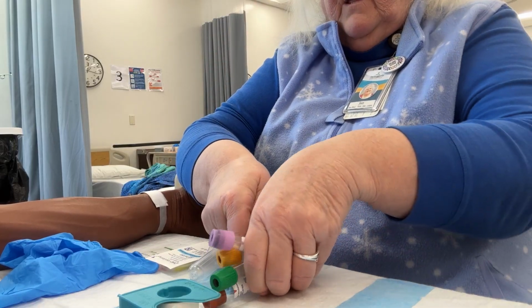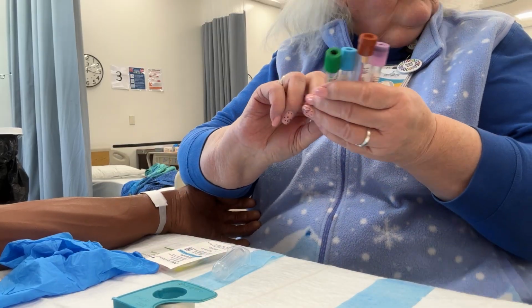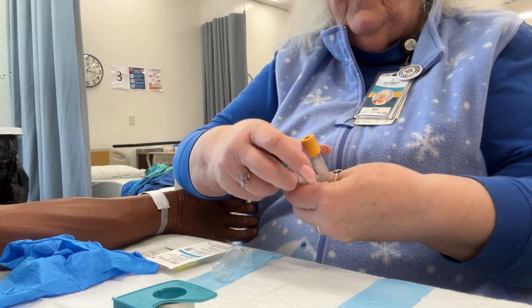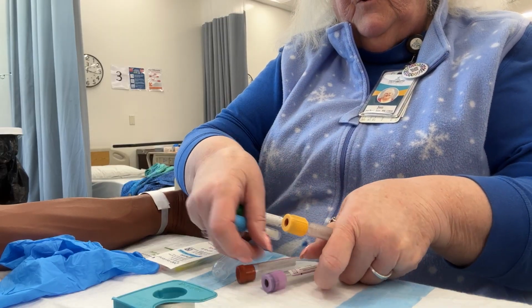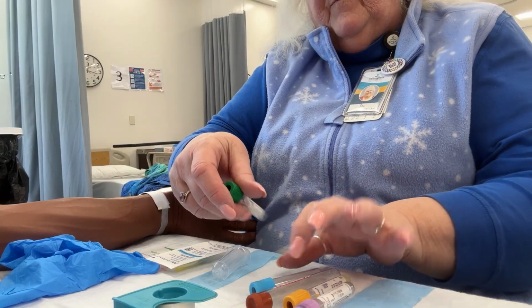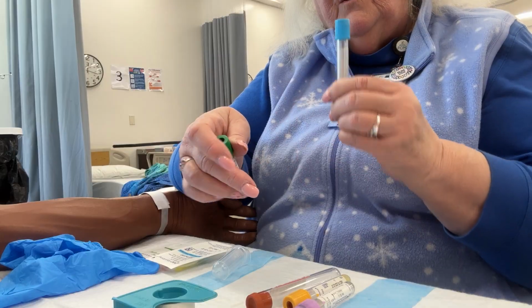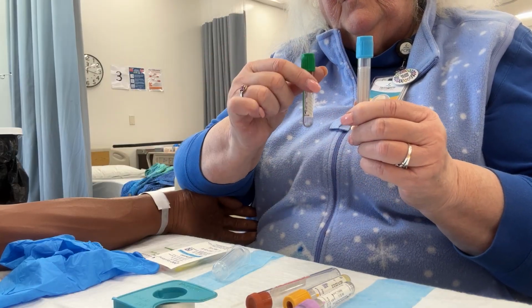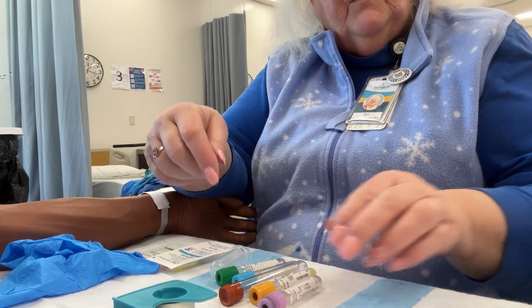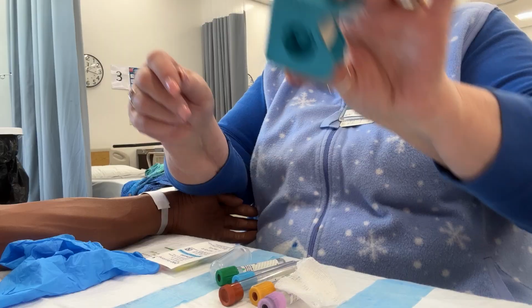The tubes that you will need based on the orders on your lab sheet, which are in the red lab container, and you're going to want to put them in the order of the draw so you know which order you're drawing them in. Now, because a butterfly has a long hose, you do need to have a tube before the blue one to get rid of the air. Okay, so I'm going to use a green for that, gauze, and of course tape.